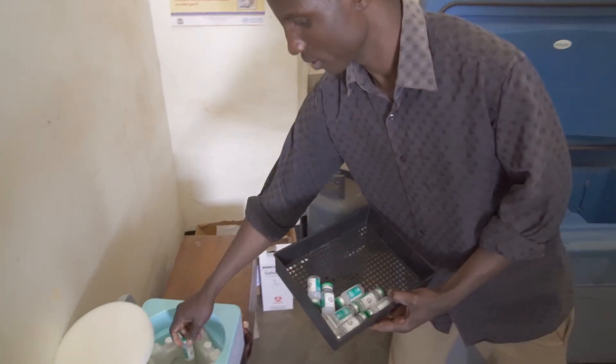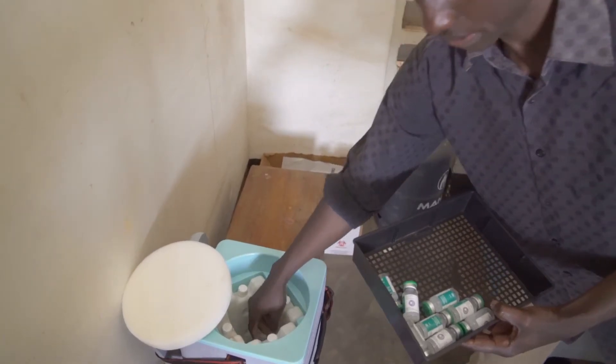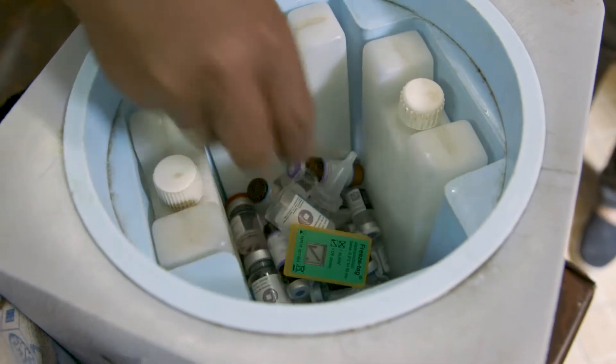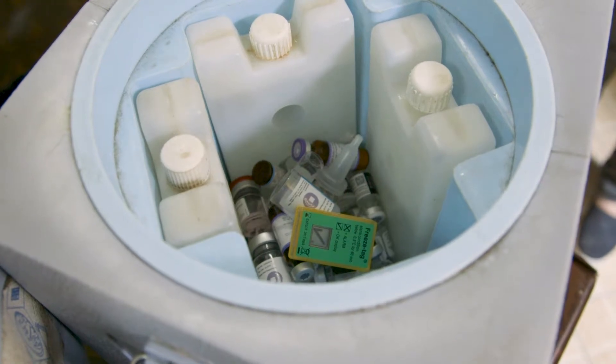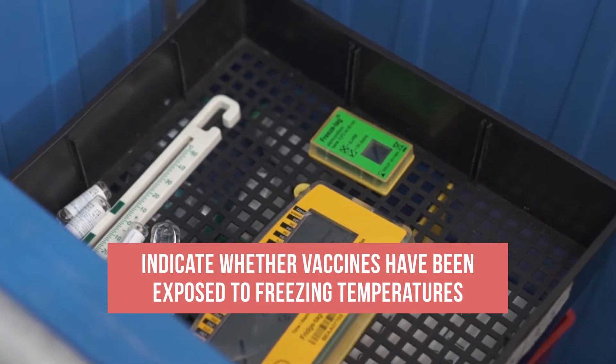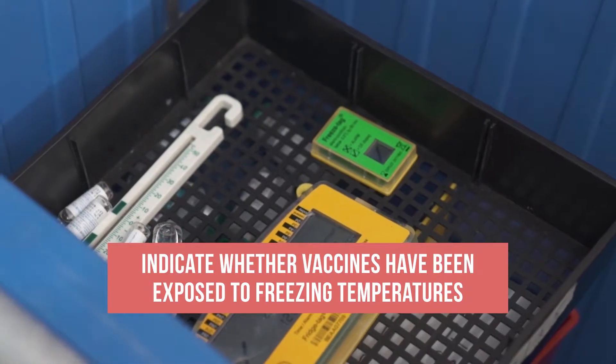Electronic freeze indicators help ensure these vaccines are protected. These small digital devices are placed with freeze-sensitive vaccines during transport or storage. They indicate whether vaccines have been exposed to freezing temperatures.